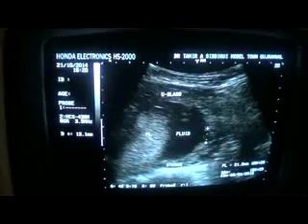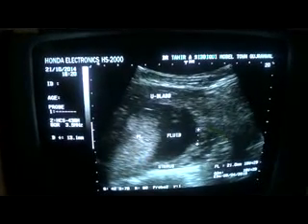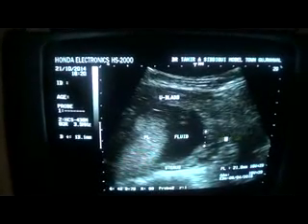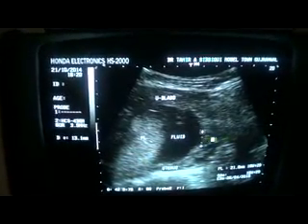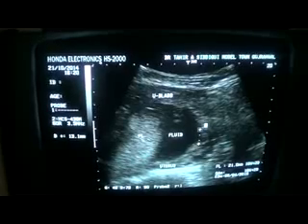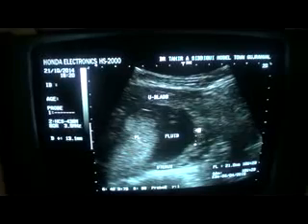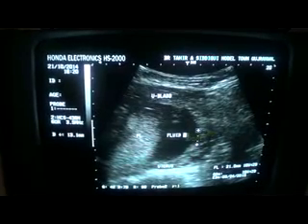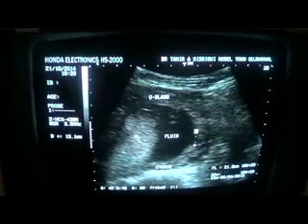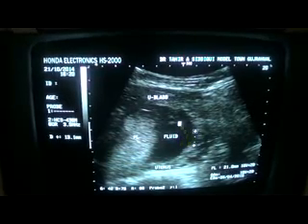Thank you very much. Now see this segment. Now this is the cervix, anterior lip of the cervix, posterior lip, the vagina. Rather, I will say this is the vagina. This is the cervical canal. To be very accurate, see the anterior lip of the cervix being elevated, posteriorly depressed, and the cervical canal dilated with amniotic fluid entering into it. The cervical canal is dilated up to 13.1 mm in this scanning plane.